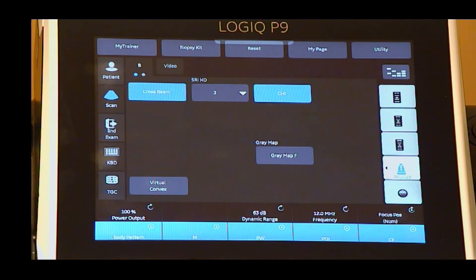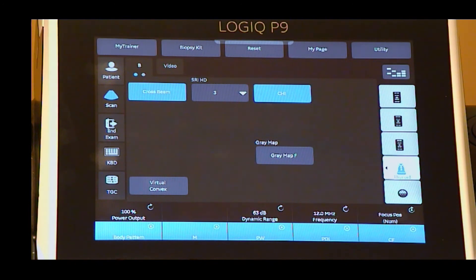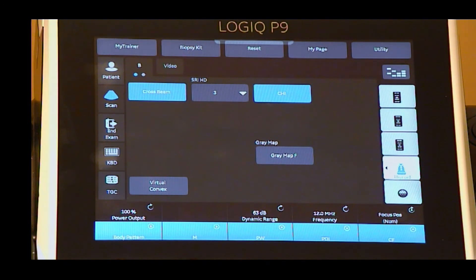Push and turn the focus button to increase or decrease the number of focal zones, or turn to move the focal zones to the area of interest. Multiple focal zones may provide better resolution but can slow the frame rate. Ensure that the focal zones are centered to the anatomy of interest.